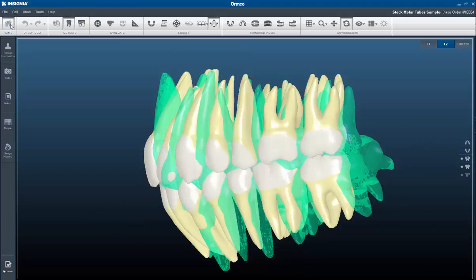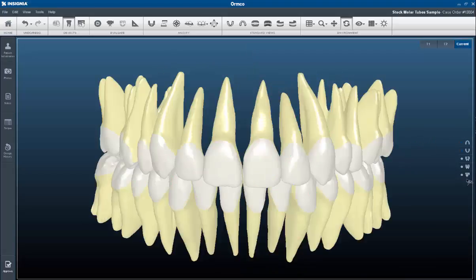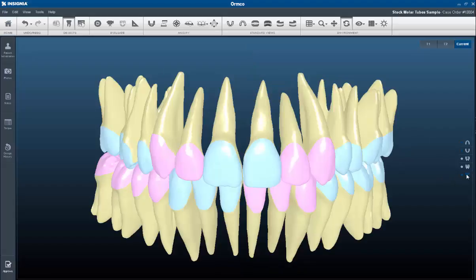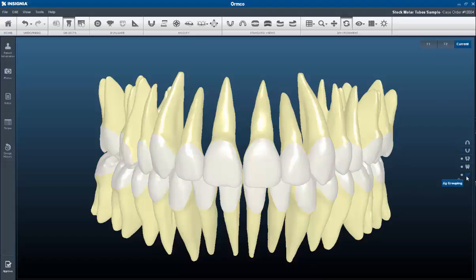The Jig Button tool gives you the ability to see the proposed jig grouping design for the patient. If you would like to overrule the current jig grouping, you can write a note to the technician.